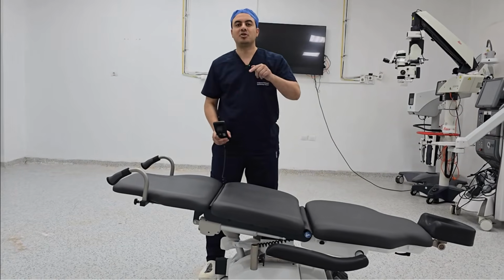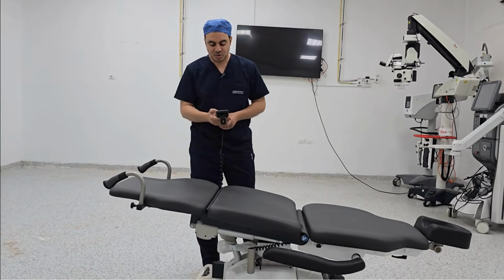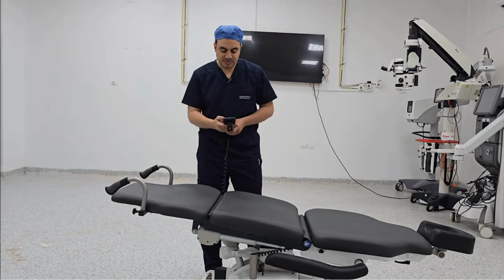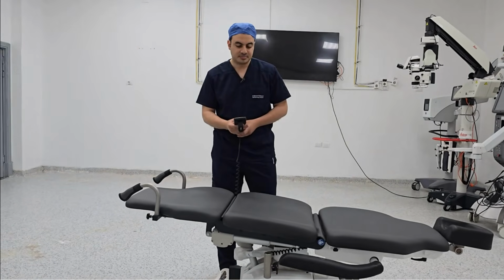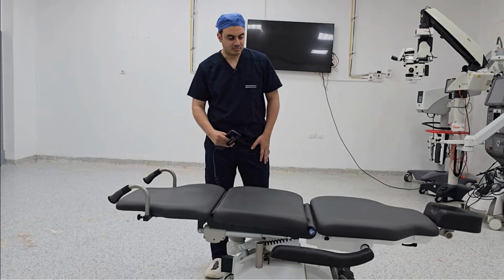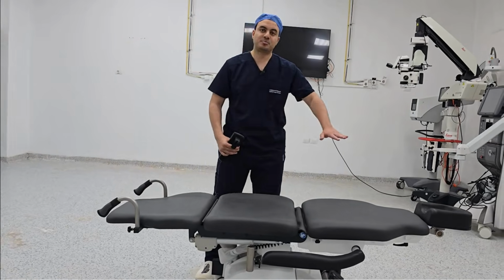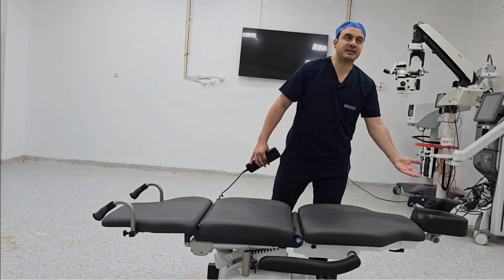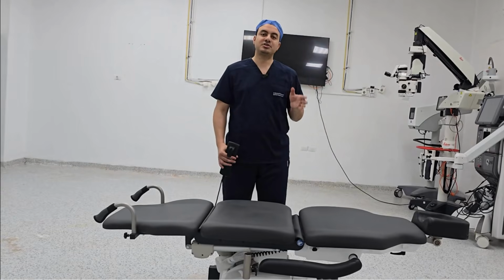So you use this position to treat the vasovagal attack. Make the table go back to its primary position. Make the patient supine, with the face of the patient facing the ceiling.